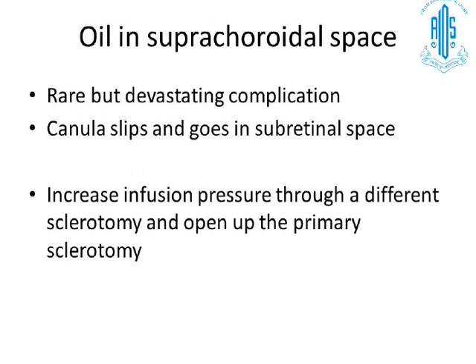Suprachoroidal space, very, very rare, but if it happens, it's a very devastating complication, and one must avoid it by checking that the infusion cannula is inside the vitreous cavity before you start.